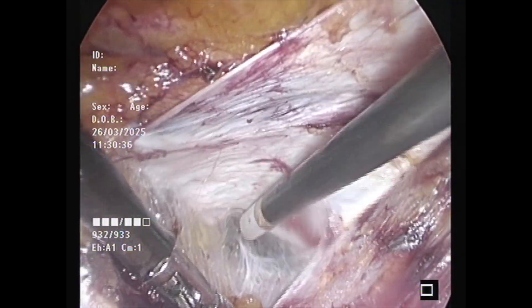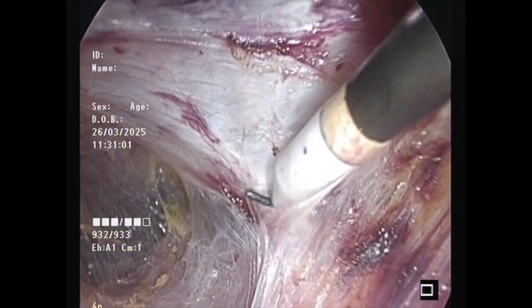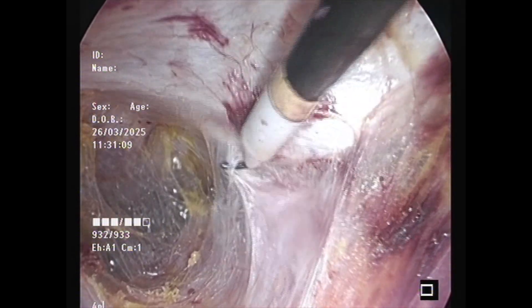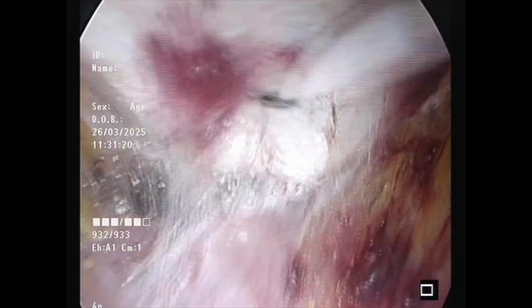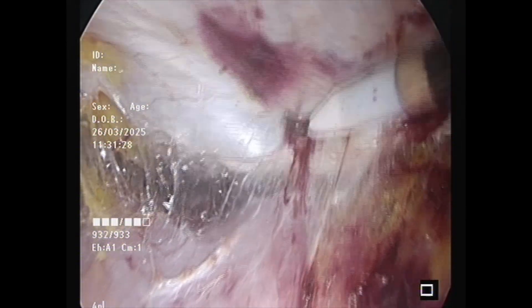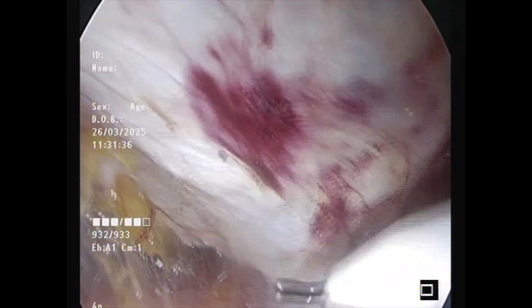Once you get sufficient length of instrument going inside, there is less fear of the instrument making a rent in the peritoneum. Wherever there is a red area, you can safely assume that you have missed the plane of transversalis fascia. So you can take the hook, take the transversalis fascia down, and then the dissection becomes much easier and much faster.